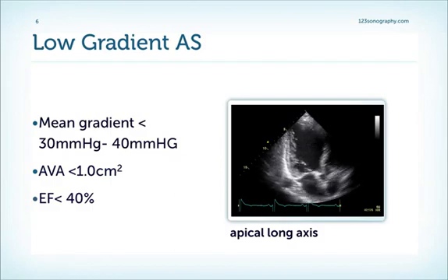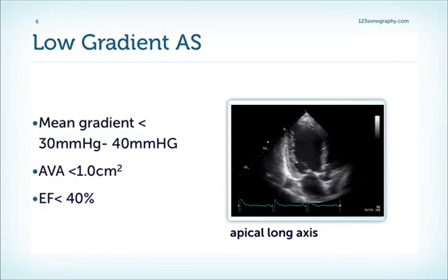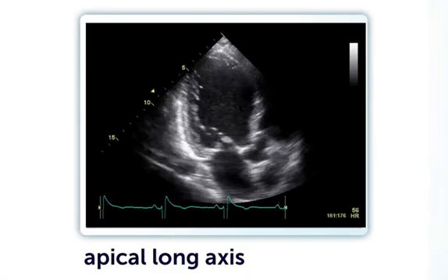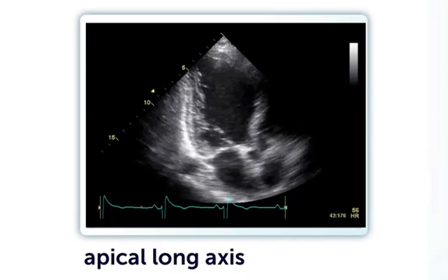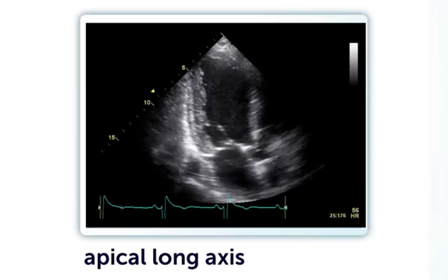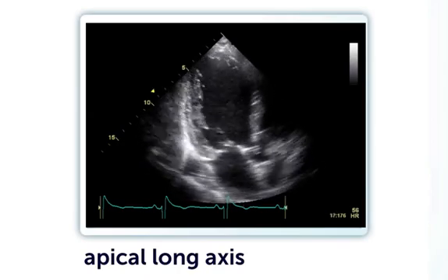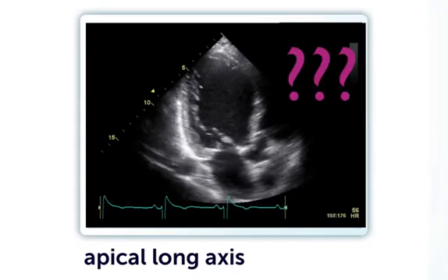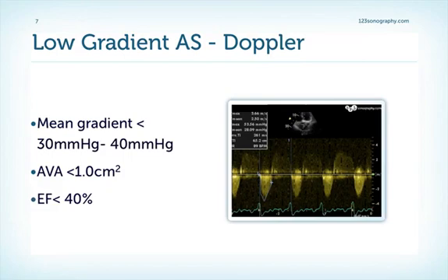Low flow, low gradient aortic stenosis is also defined as having a calculated valve area below one square centimeter and an ejection fraction below 40%. Here on the right, you can see in the apical long axis a highly reduced left ventricular function with a severely hypokinetic or even akinetic apical area. Perhaps this patient has ischemic heart disease leading to low output, and we can see the heavily calcified aortic valve. So does this patient have low flow, low gradient aortic stenosis? When we perform the Doppler, we find lower mean gradients than we might expect.